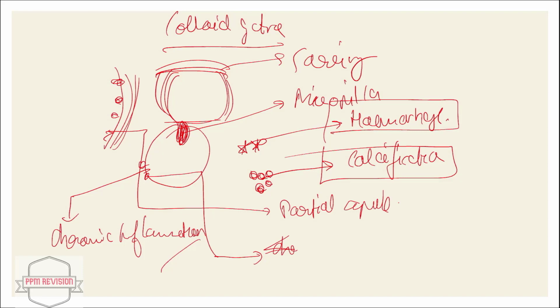Within the distended acini, there is marked accumulation of colloid, which is homogeneous and acidophilic, staining pink. Between the lobules, there are bands of fibrous tissue containing capillaries, extravasated RBCs, and occasional small round cells.